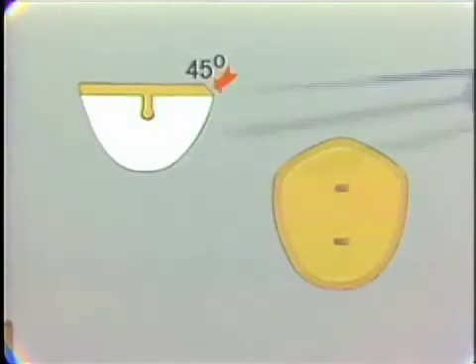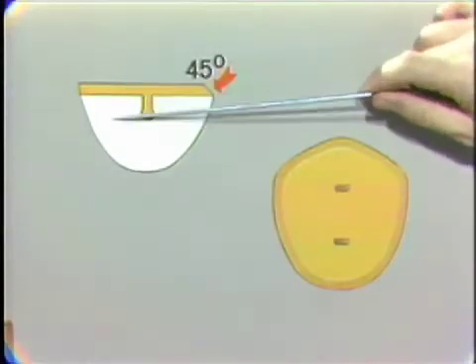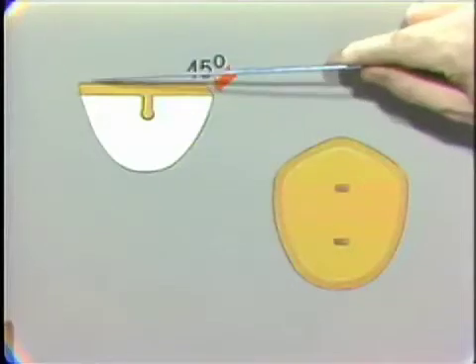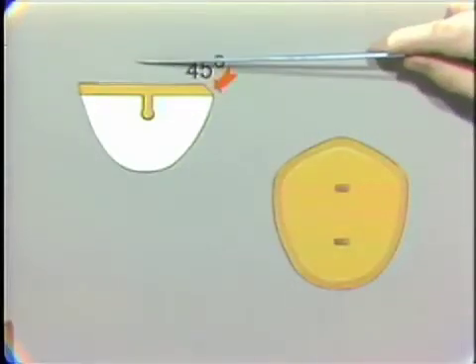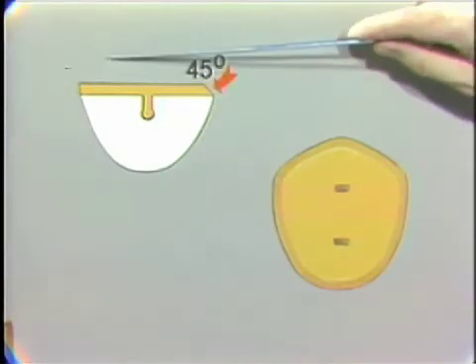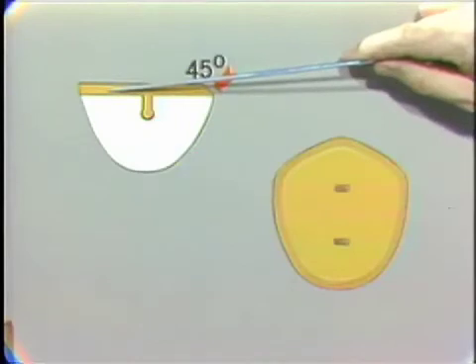The relationship which we've established between the gold backing and the porcelain at the present time is shown on this side of this diagram here. Now, if we were to leave that type of relationship and then wax up the occlusal surface here, invest and then cast, in the finished pontic we would have cast gold here with a thin rim of the backing exposed in this area here.